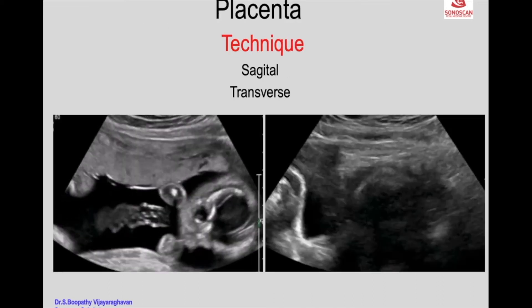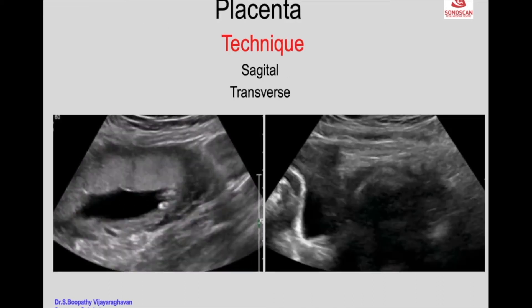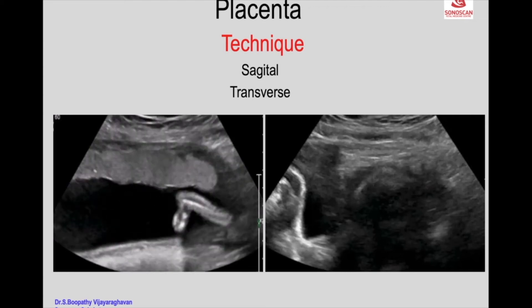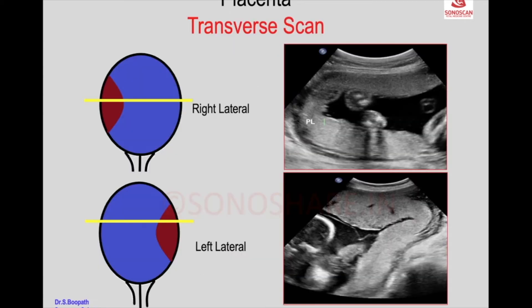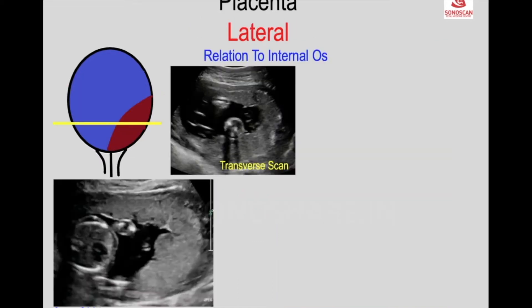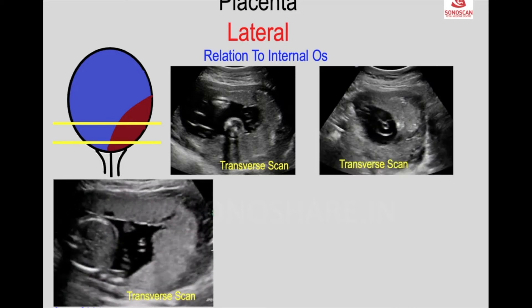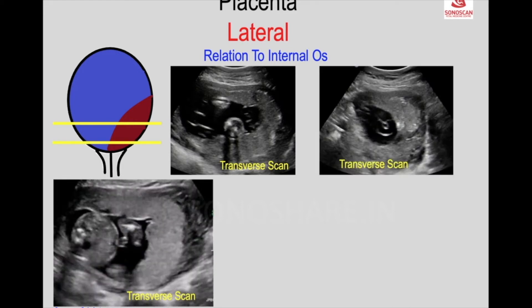This is the sagittal sweep from side to side. The placenta is lateral, and its relation to the internal os cannot be assessed — that is a disadvantage. To overcome this with a lateral placenta, you make a sweep transversely when the placenta comes down.